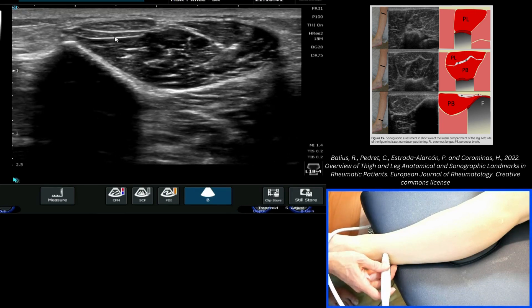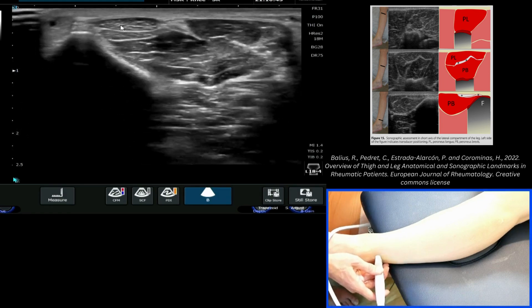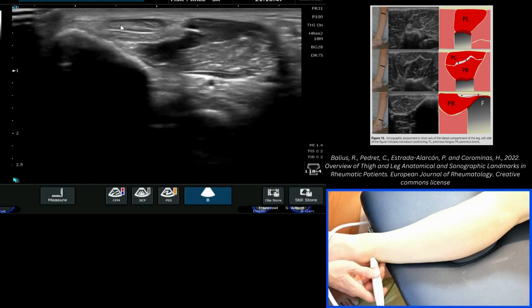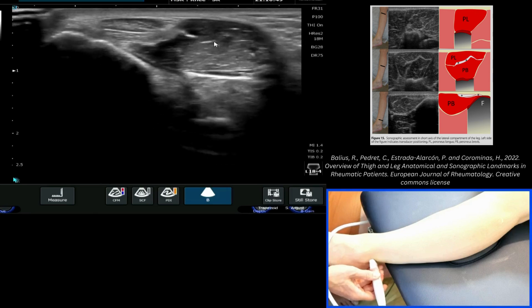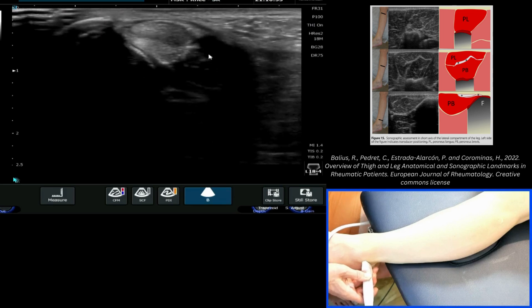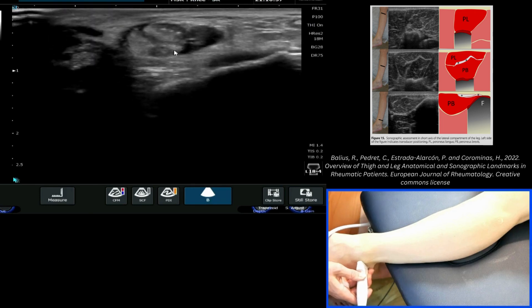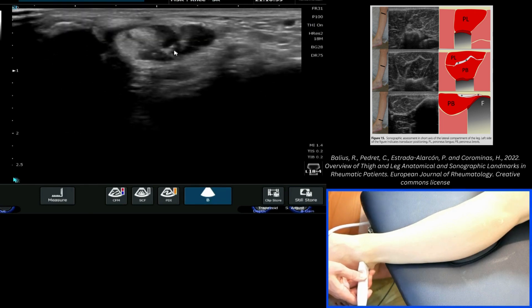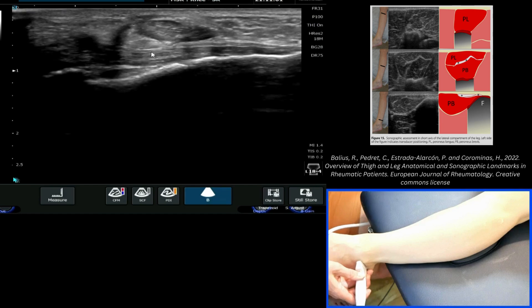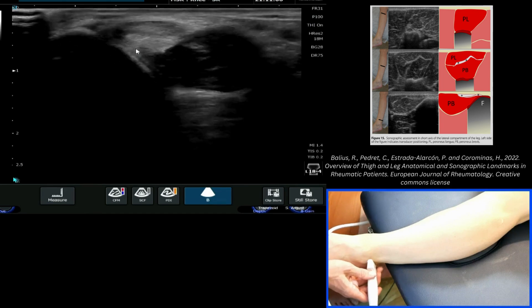Here we see the muscle belly of brevis. This is the brevis tendon; the longus tendon has already formed. As we come down, we see that brevis muscle with the last few fibres attaching in, and we end up with the two tendons here in the retromalleolar region — just before we get to the CFL, the calcaneofibular ligament, which we'll come on to later. But you see the longus and the brevis here.